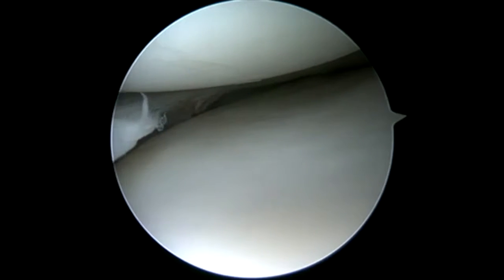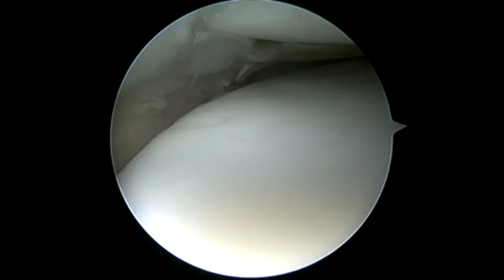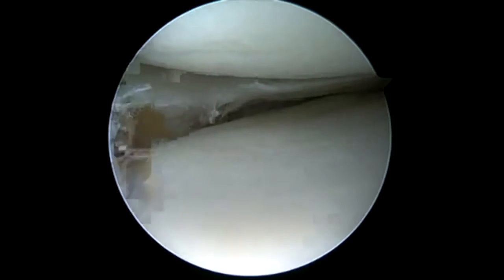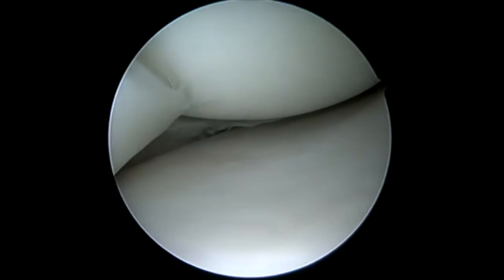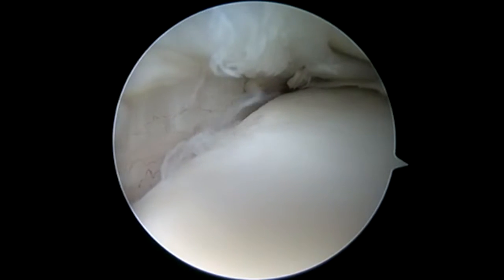Now we're going to move on to our medial meniscus. We can see this is a very tight compartment. If you don't trephinate this collateral ligament, you're not going to be able to see all of the meniscus. We can see that she's had a removal of at least part of the middle one-third, and it looks like the tibial side of the meniscus — the femoral side appears to be intact.